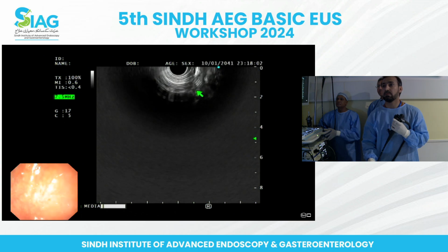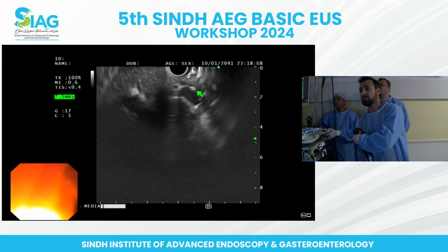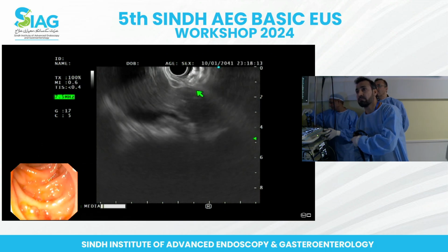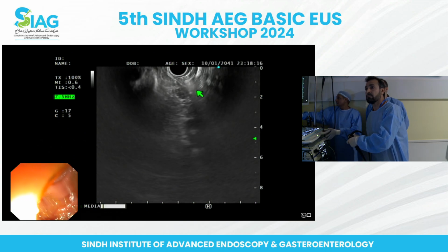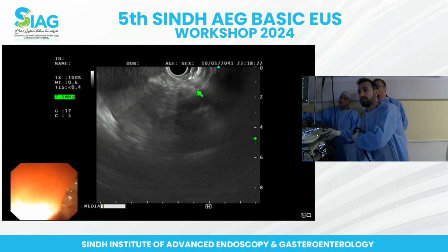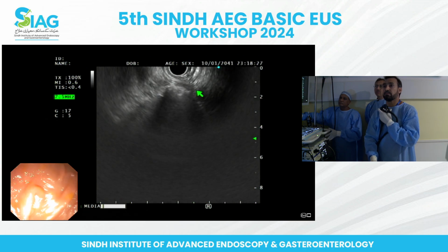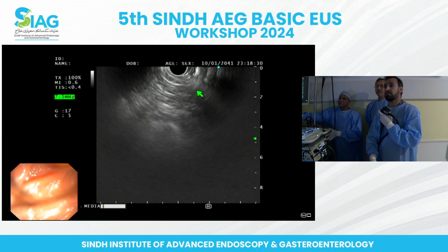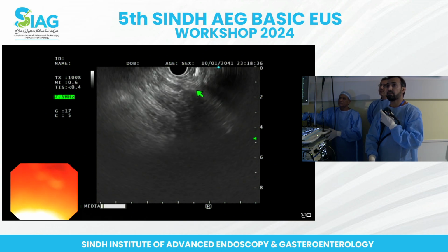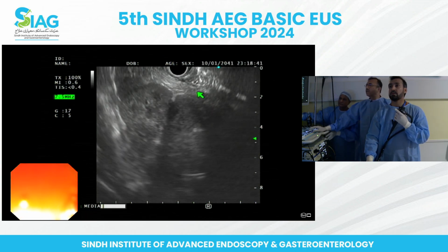So identify the papilla. You can go either EUS-wise or endoscopic-image-wise. You're going down and now you need to pull back. Okay, fair enough, very good. Now you're way down into the duodenum. So now stop insufflating air, go to the suction. With right left movement, kidney is a big structure and this is the kidney that you have, right? This is the kidney that you have.